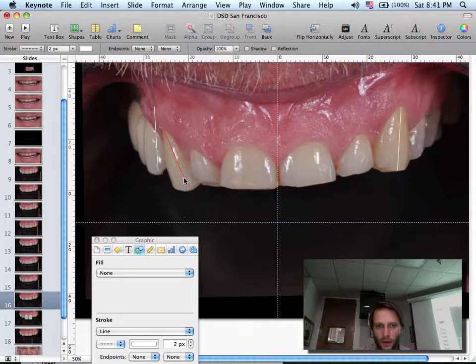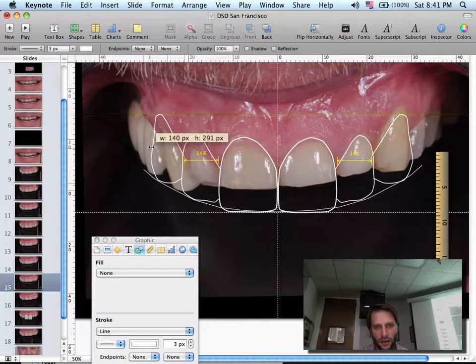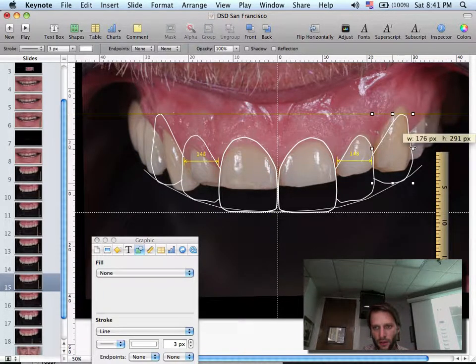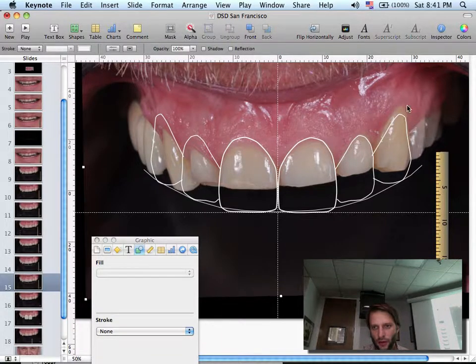But now if we are playing with restorative only. This is impossible. I need to bring this in. Maybe a little longer. This one I can grind a little bit more and make it narrower, so I'm trying to make them a little bit more equilibrated. And the thing I'm going to do here, definitely I will not prep all the way up over here. I will do a complete supragingival preparation and a little veneer that starts from here and has a nice proportion and looks better. And then you will have like a root shape over here.